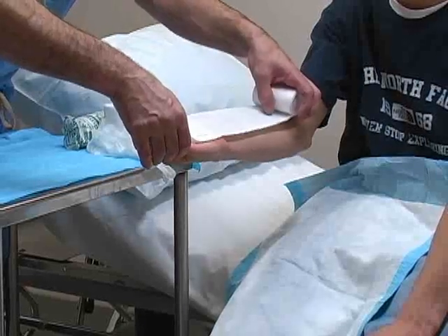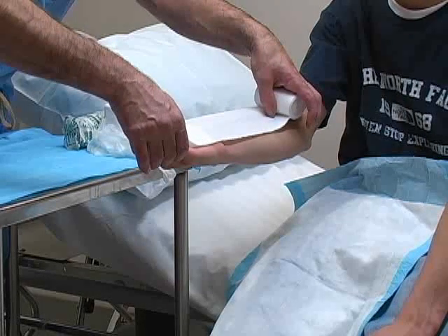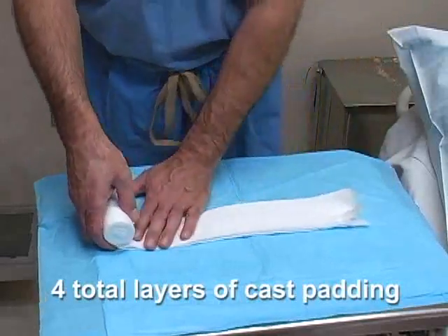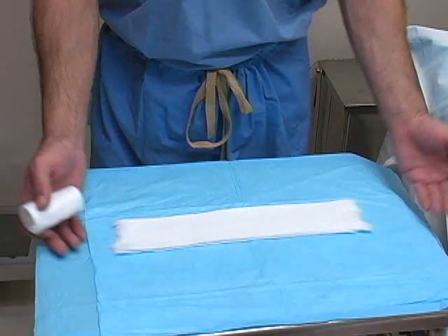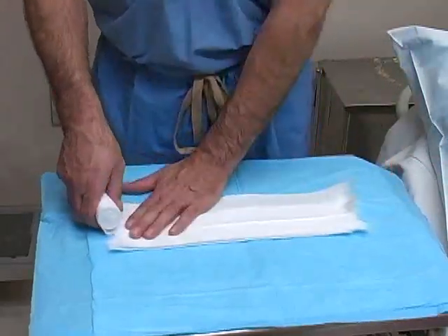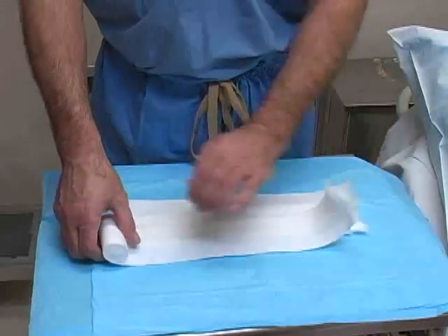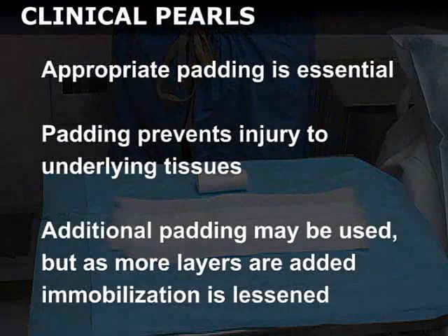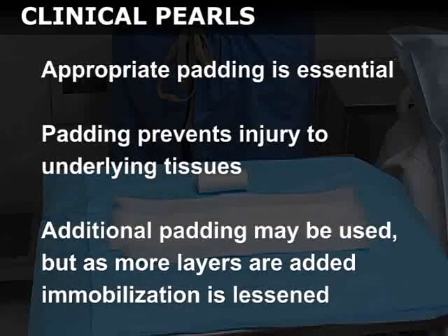Begin by measuring the length of the splint by placing a section of cast padding along the extremity. Next, roll out four layers of the padding on a bedside table. The first three layers should lie directly on one another. Two strips of padding are used to make the top layer and these are offset from the center — the overhanging edges will be used to fold over the plaster. Appropriate padding is essential in making a good splint, as it prevents the hardened plaster from injuring the underlying tissues and bony prominences.